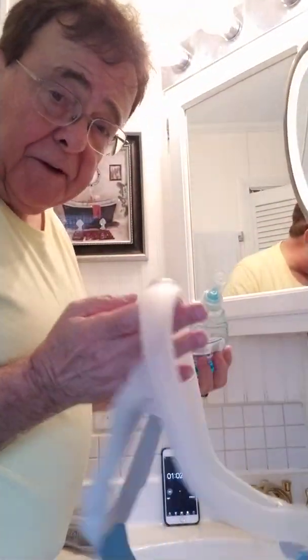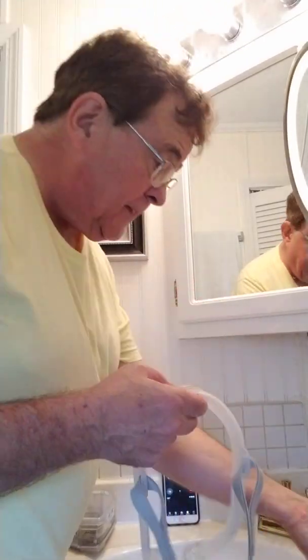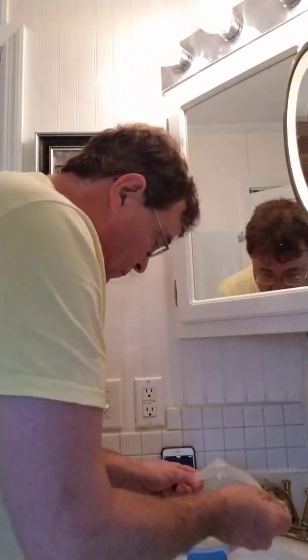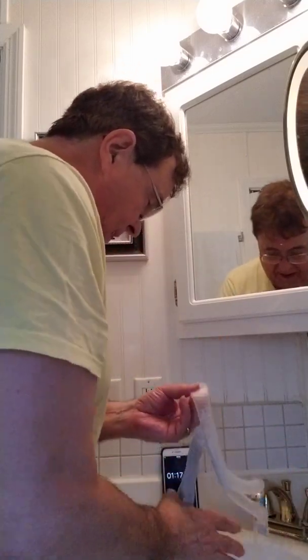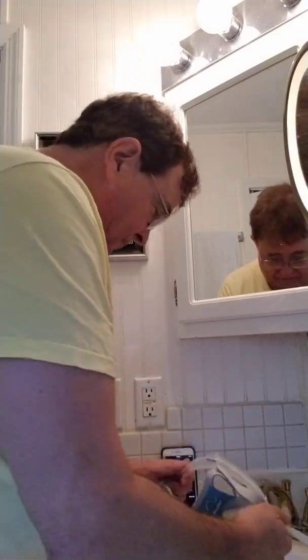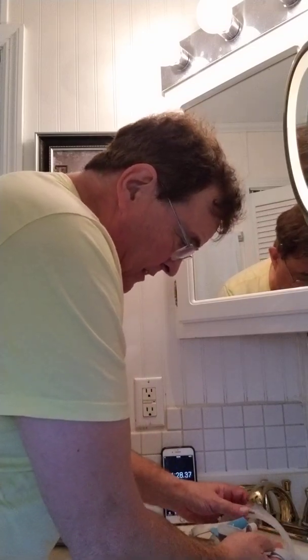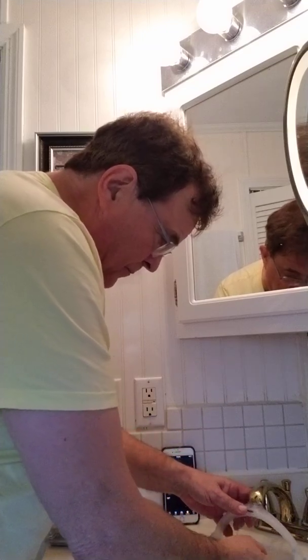And so now here's my little head or frame. Just put a little bit in there. And go in here. Oh, man, I'm really messing up today. It's supposed to hold the headgear so it doesn't get wet. Oh, well. I'm not going to use it till tonight anyhow, so it'll be done. And just rinse water through it real good after it runs the soap out.